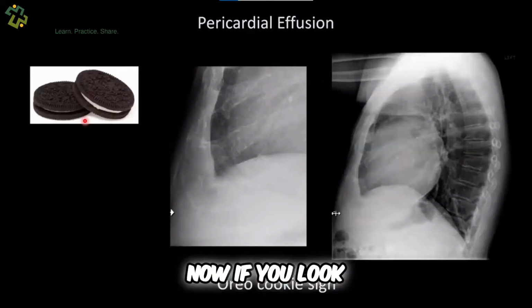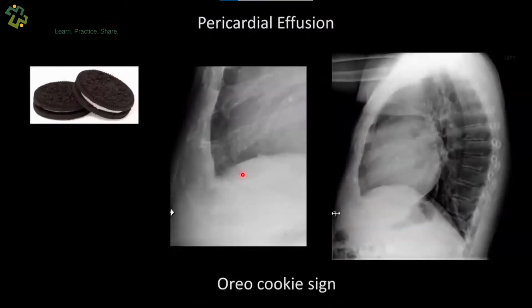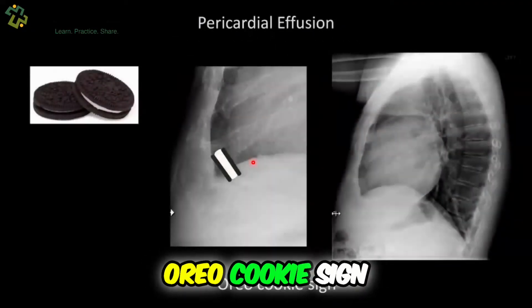The important aspect is that it consists of a layer of white cream, which is sandwiched between two dark, supposedly chocolate biscuits. Now, if you look very carefully, you can see the same configuration here at the front of the heart. Look at that. Can you see it? Black with white in the middle. Boom! Oreo cookie sign.